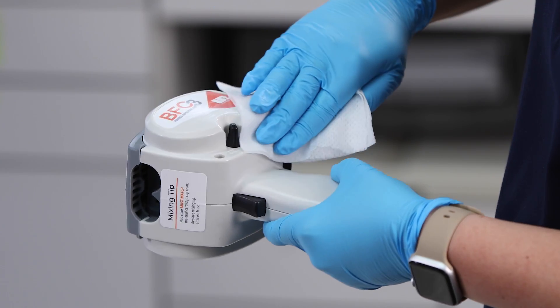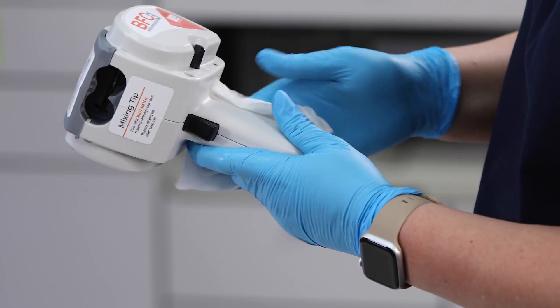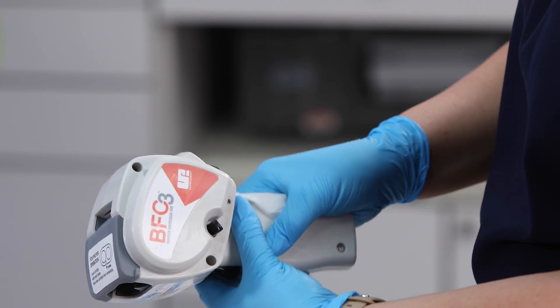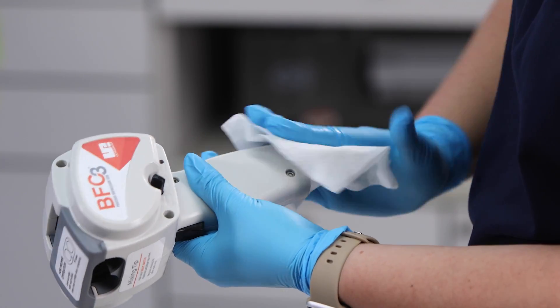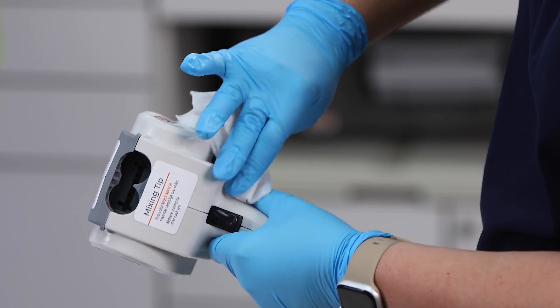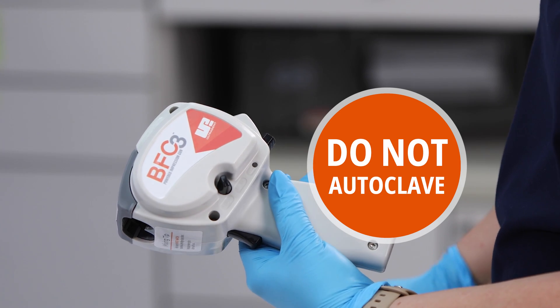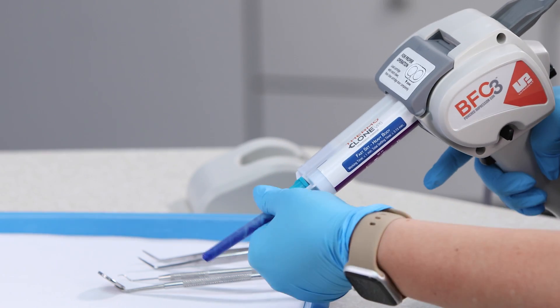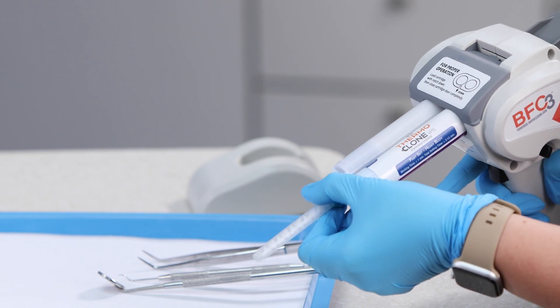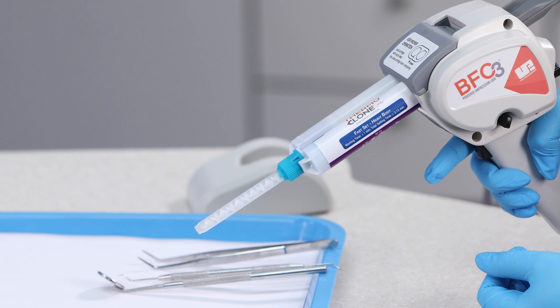After the impression has been completed, wipe down the tip, cartridge, and BFC3 Impression Gun with an appropriate surface disinfectant, and leave the used tip in place to prevent product contamination or drying out. The BFC3 can be cleaned with any surface disinfectant. Do not autoclave the BFC3. Before the next procedure, be sure to replace the used mixing tip, as it contains hard material that will stop the flow and possibly damage the BFC3 Impression Gun.